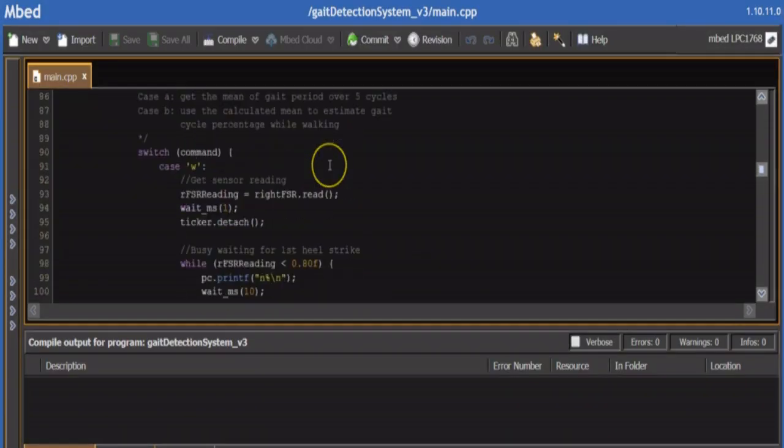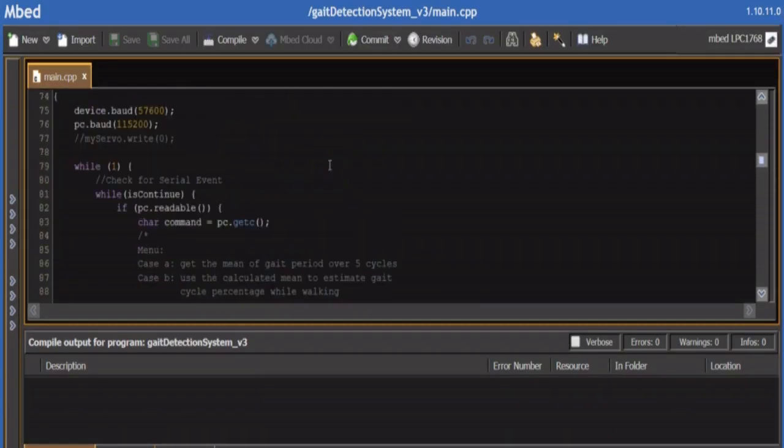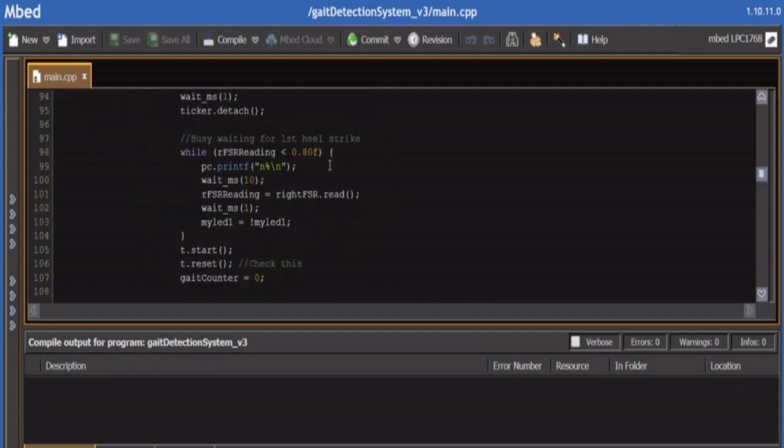In terms of control, our exoskeleton has a gait detection system that monitors the gait cycle of the user in real time. The exoskeleton also has a controller that applies the desired torque during the gait cycle. The gait detection system relies on a force resistive sensor that is inserted under the insole of the boot. This sensor detects the heel strike, which is the beginning of each new gait cycle.